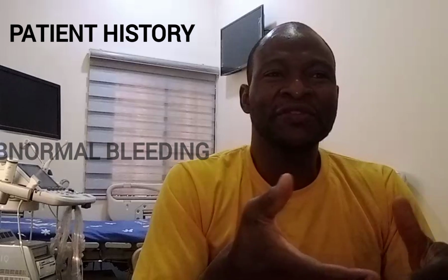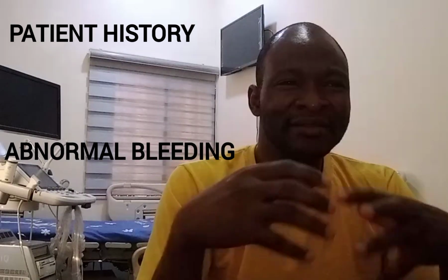So we talked about taking good history. You see, taking good history is very important so that you'll be able to recognize significant clinical information. A good history is to be taken before starting the scan. A good history will include information such as last normal menstruation, history of unusual or abnormal bleeding, and other significant clinical signs and symptoms.